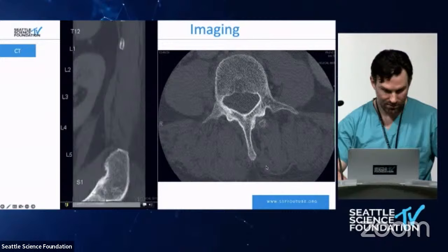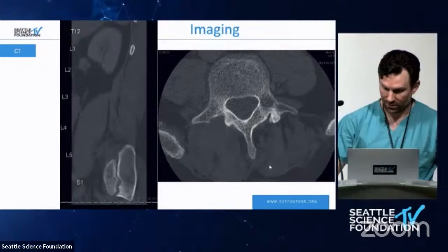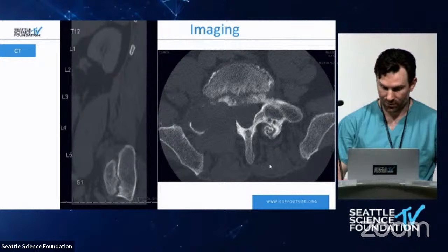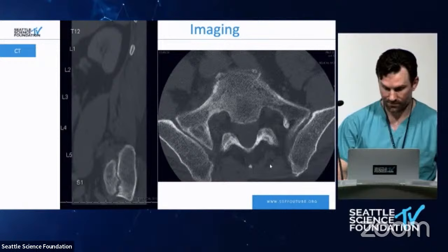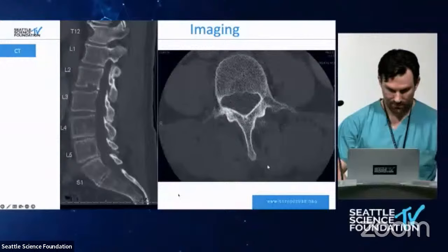And here's some preoperative CT imaging. This demonstrates a fluid-filled lytic lesion, or assumably fluid-filled, invading L5, severely compressing the right L5 and S1 nerve roots, and it has sclerotic margins around the edges. I'll play it one more time. So again, we always look at the margins. This is obviously an expansile lytic lesion.